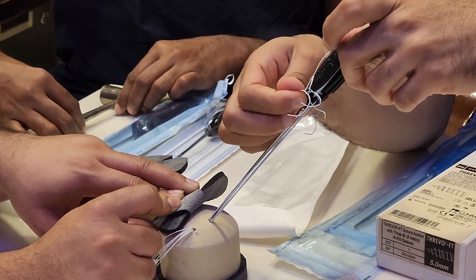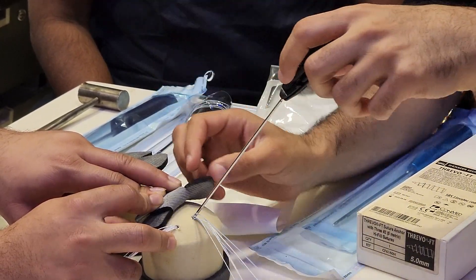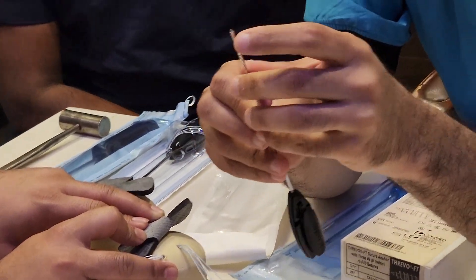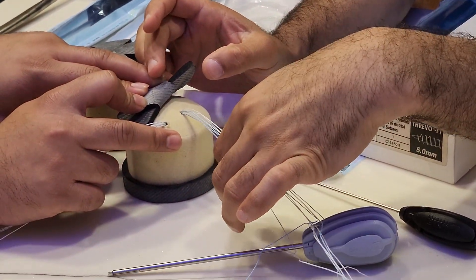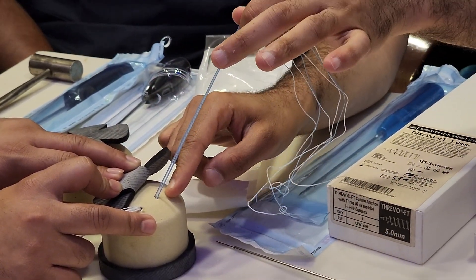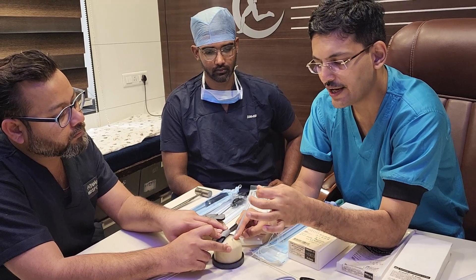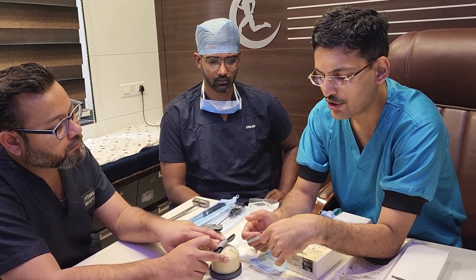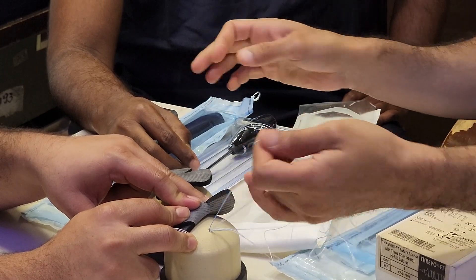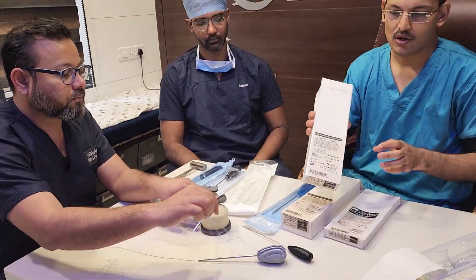Once it reaches the black line, you remove the inserter and pull it out. The inserter has very sharp teeth which allow the anchor to be inserted firmly. This is again a triple-loaded anchor with very good pullout strength, but the strength is dependent on very good cortical bone — so it must be used only when you have intact cortical bone and you have not burred away the cortex. You can also perform a seesaw motion to stabilize the anchor once placed.